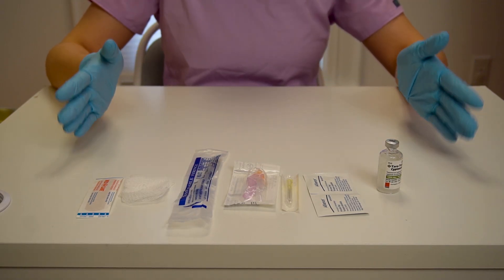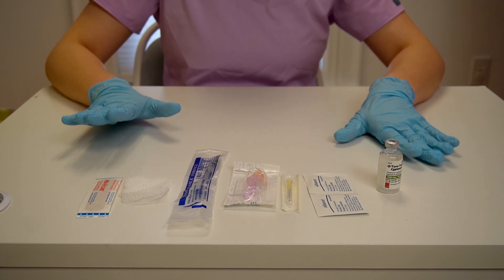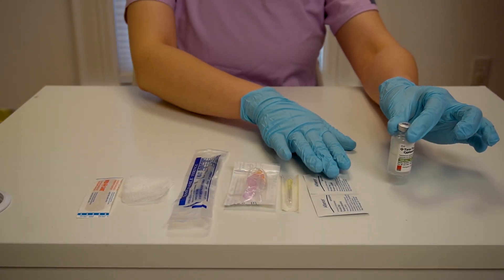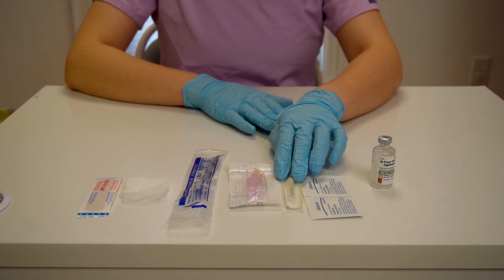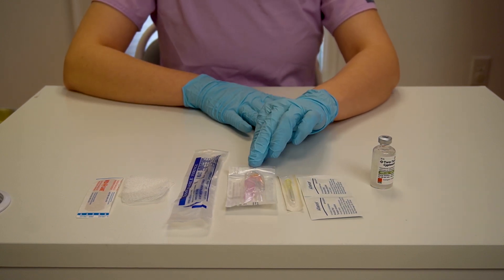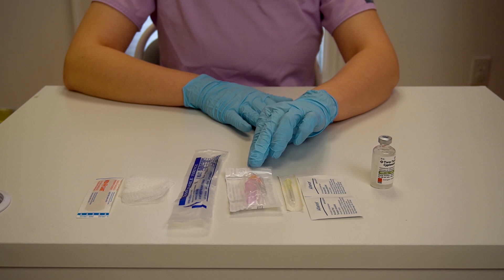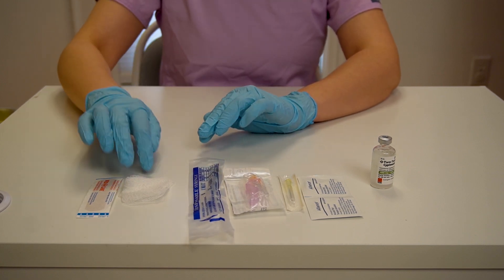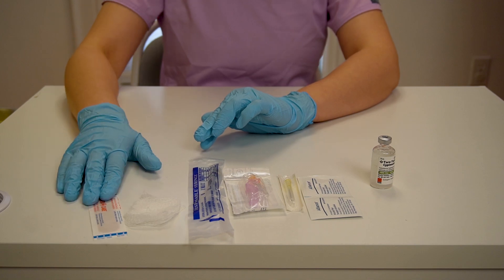Step number one: we need to make sure that we have everything we need. So our medication of course, some alcohol swabs, a big needle to draw up our medication from the bottle, a smaller 25 gauge 5/8 inch needle to do the injection itself, a one milliliter syringe, and a little bit of gauze and a band-aid as needed.